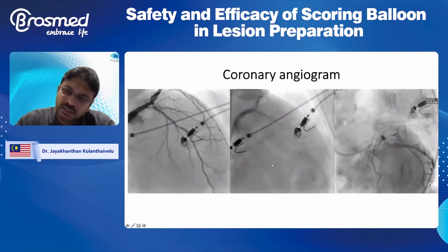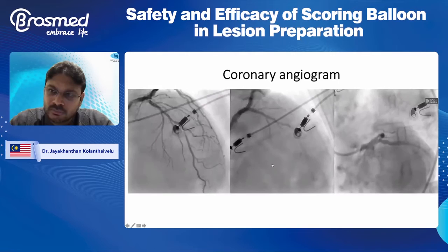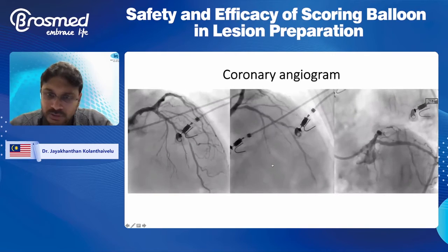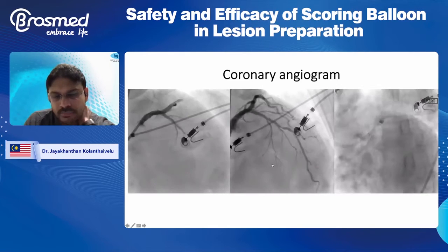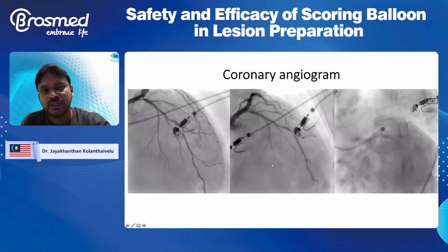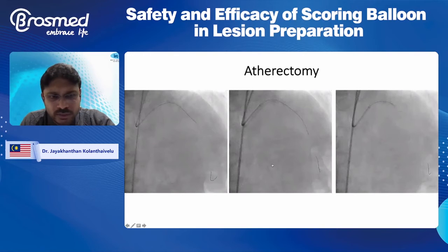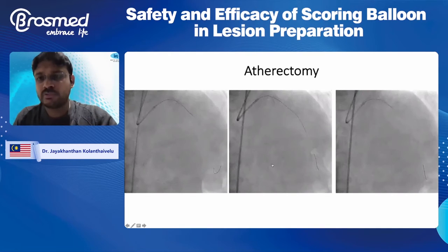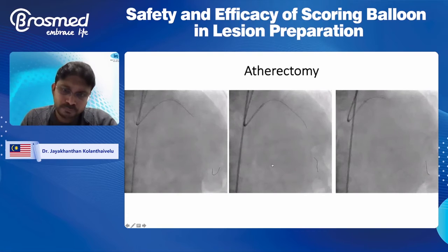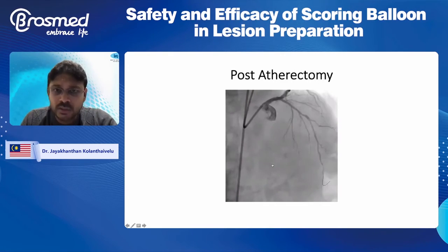Initially, because there was a tight lesion distally, we were debating whether we should use a rota system or orbital atherectomy. We felt that if we took a rota system, we might not be able to touch the calcium in the proximal. So we decided to go with the orbital atherectomy, and that's what we did. We had a little bit of trouble initially, but once it went through the distal tight lesion, we made multiple runs, did high speed at the proximal. And this is post. We felt that was adequate.